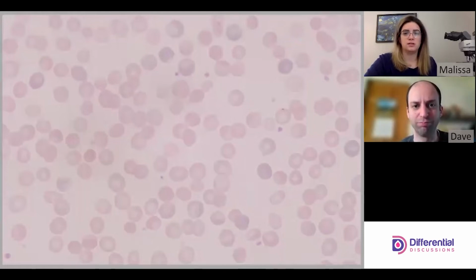So let's clear these. And then we have our polychromatophilic cells up here, which actually look really nice on this screen. We actually have really good contrast on the poly. Sometimes poly's hard to pick up. Yeah, it can be a little tricky. So this is pretty cool. Kind of a textbook HS.